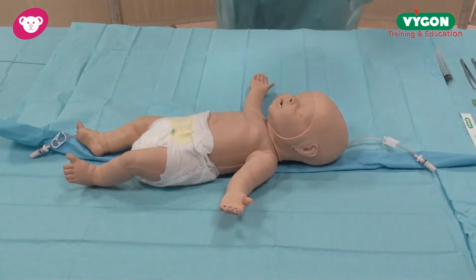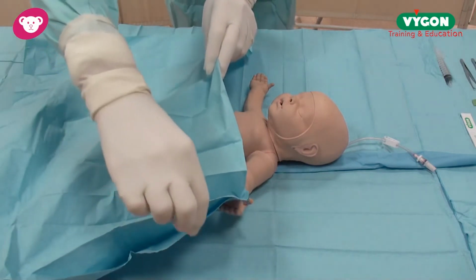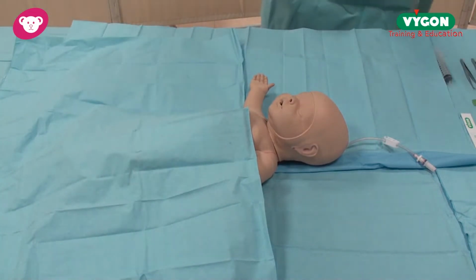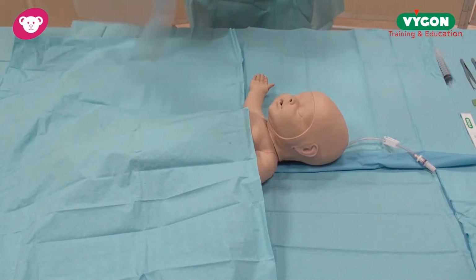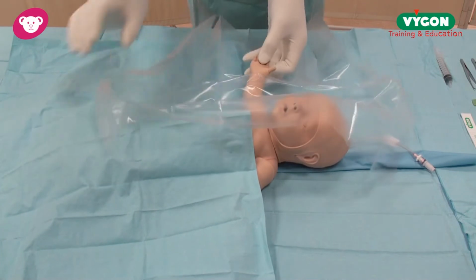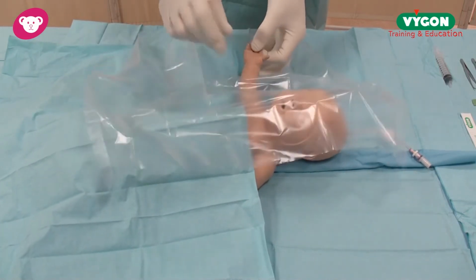The second drape completely covers the baby's body and torso. And thirdly, we have our new transparent drape. This has many benefits. One, it keeps the baby's heat in. Secondly, you can see the anatomical layout. This is placed over the baby's arm and taken up as far as possible.